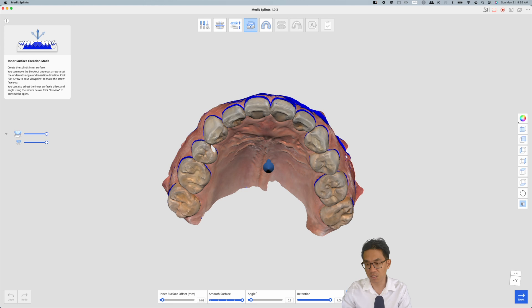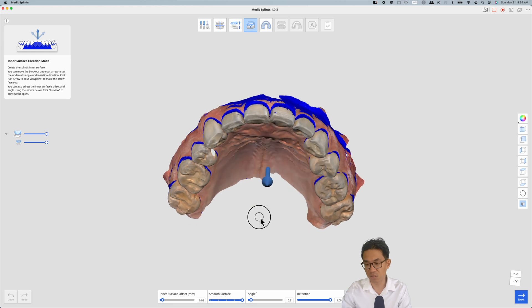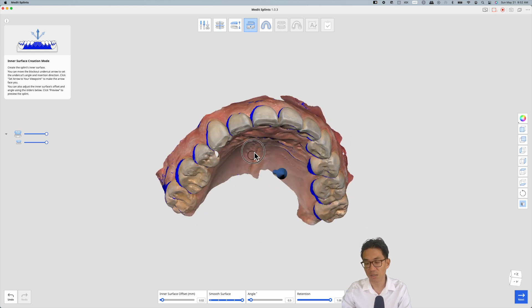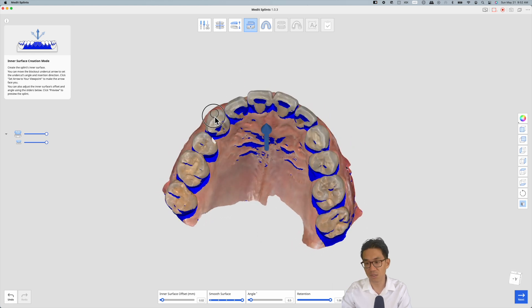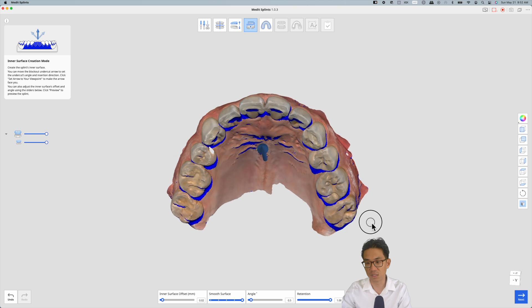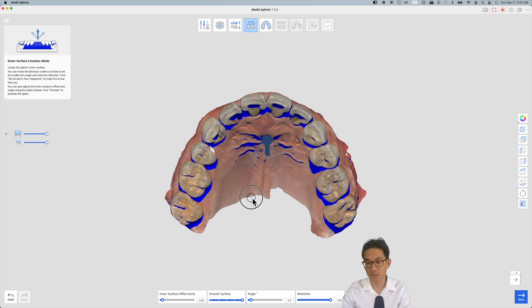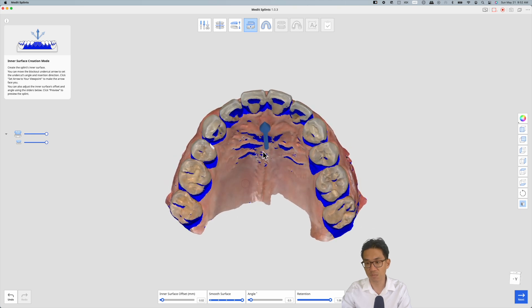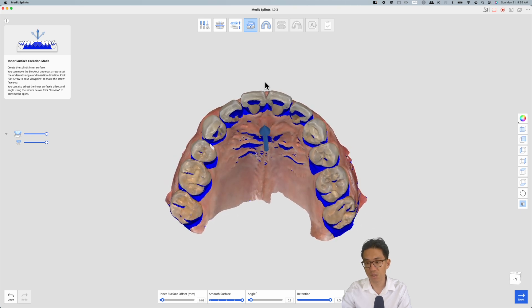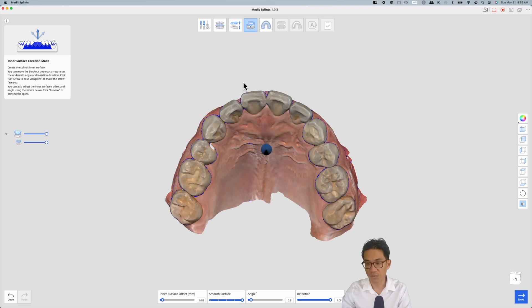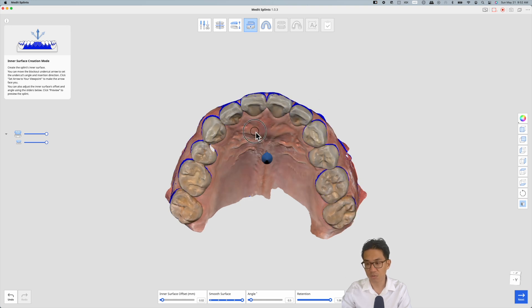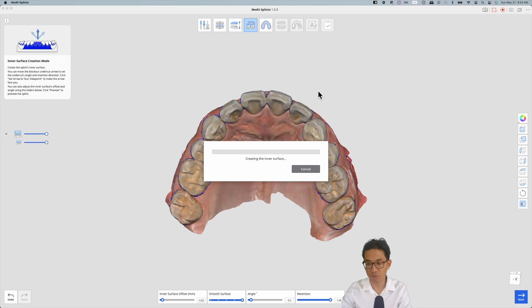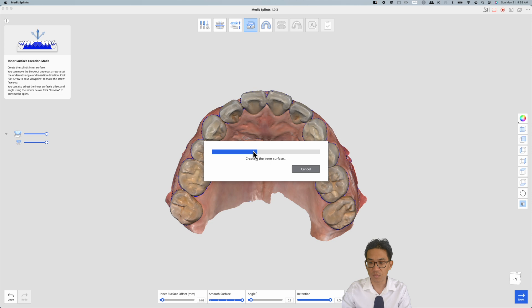If you'd like to change the path of insertion, you can hit that arrow and kind of see where the undercuts are. But in this case, we'll just set it so we're going straight occlusal to the teeth. And you can even preview what the model will look like.